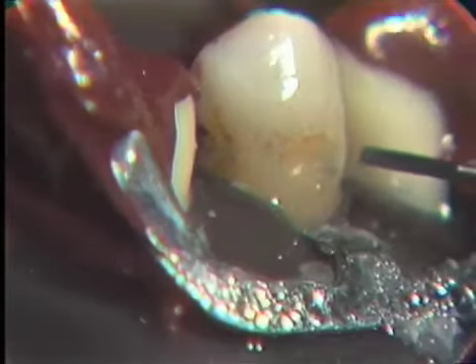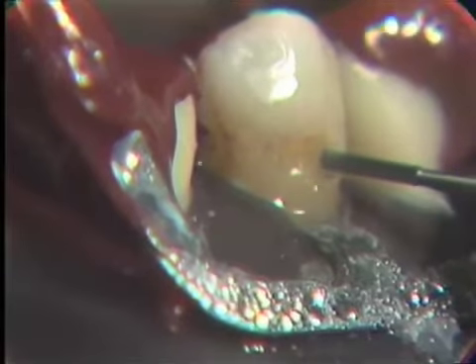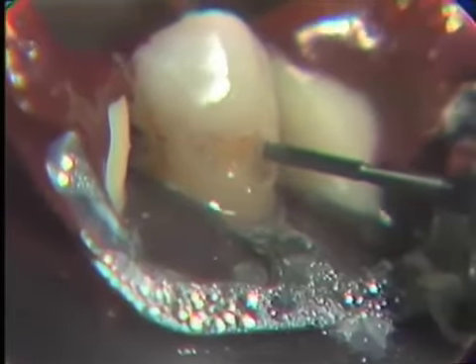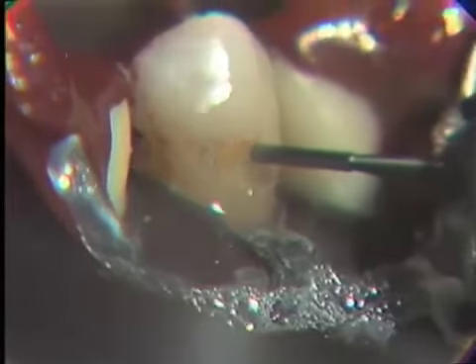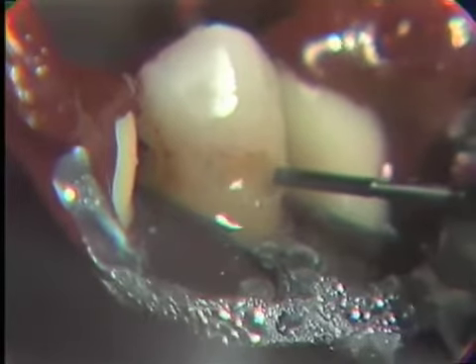Now we're trying to establish an occlusal wall that is somewhat straight across from mesial to distal and then curves as we reach the mesial and distal sides of the preparation. Once again, you will note at the mesial there is a white area of decalcification. You must extend your cavity preparation over to include these areas.